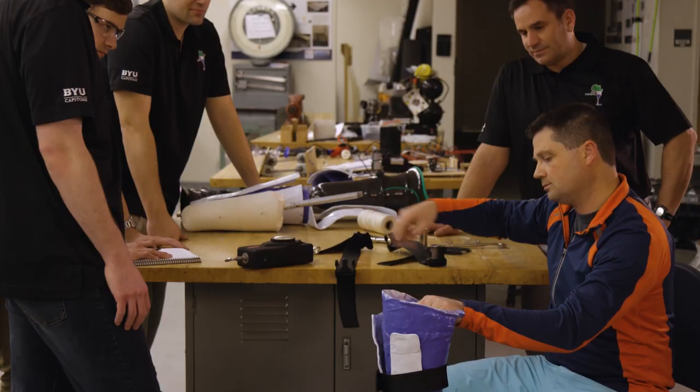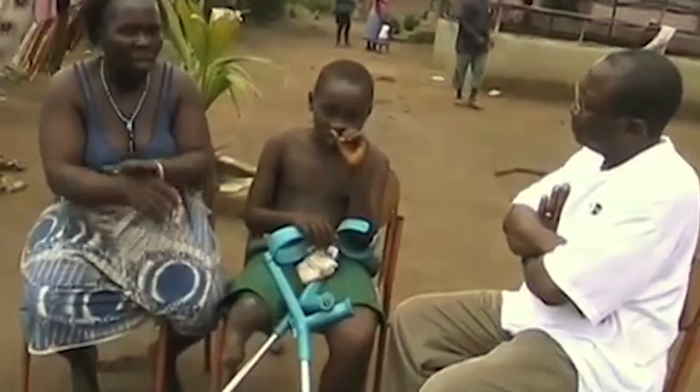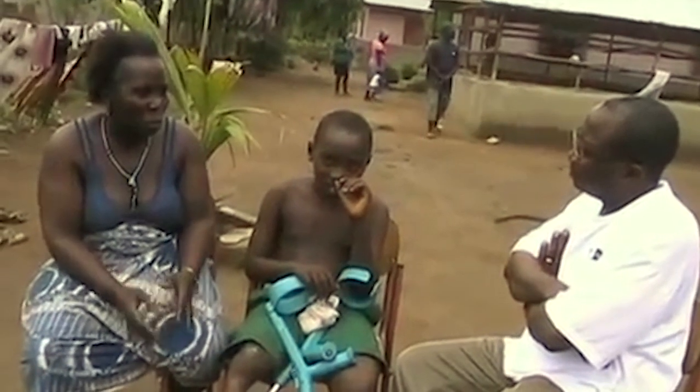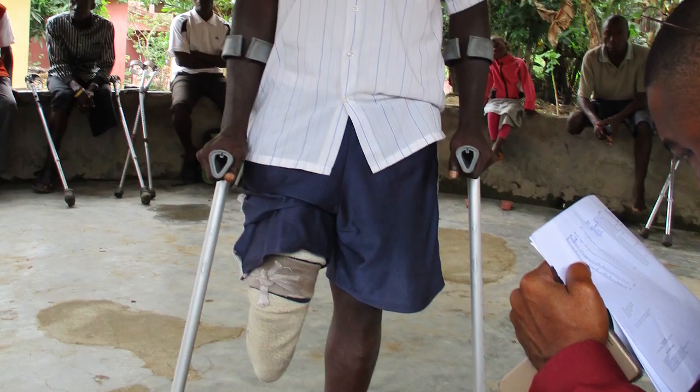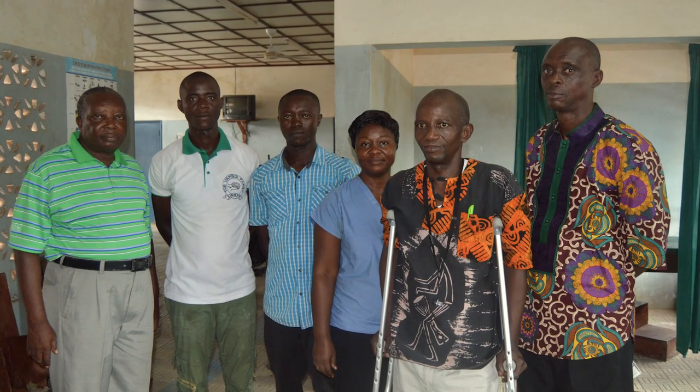For these guys to not be prosthetists, not have all that training — I think it's pretty impressive. This is a real project that's going to help real people in Sierra Leone. This socket could do more than just let them walk — it could change their lives and lead them to other directions and opportunities now that they can be mobile again.